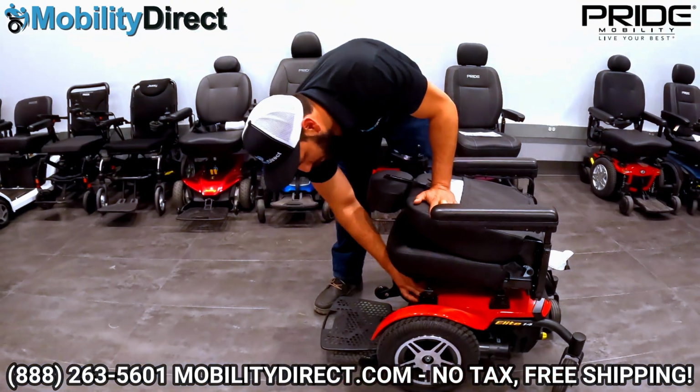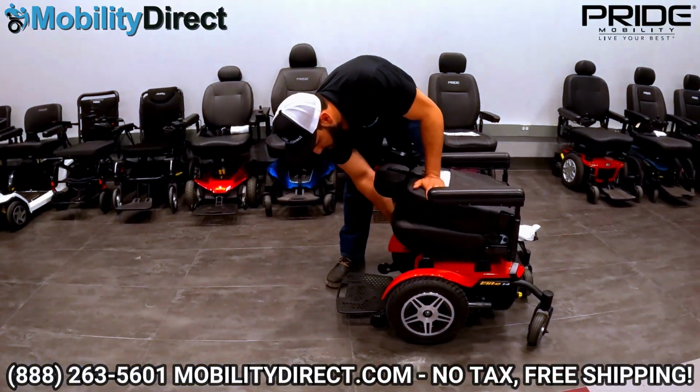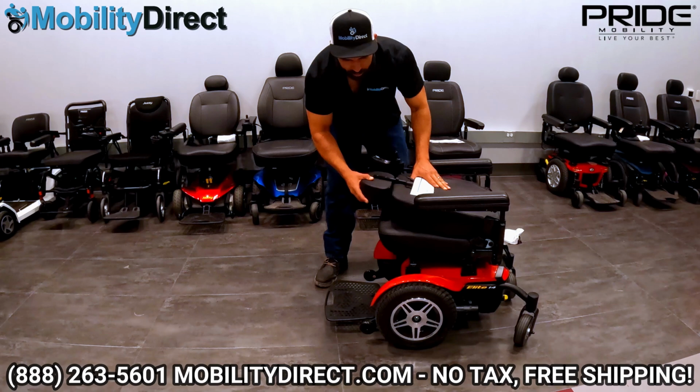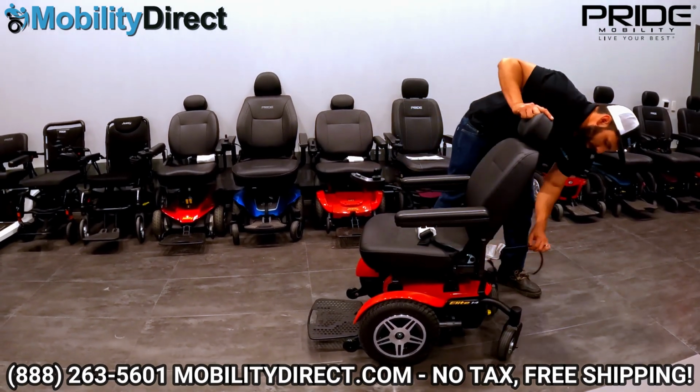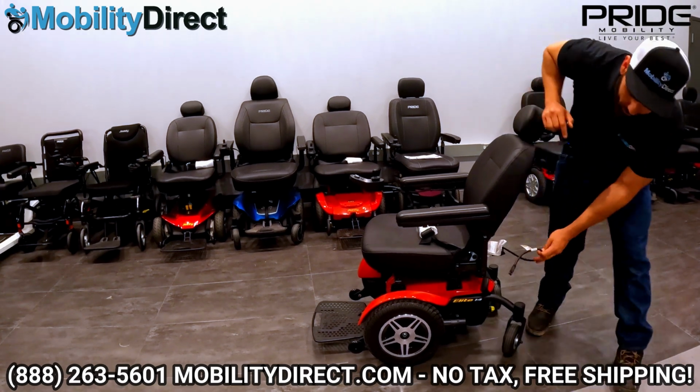I'm going to engage my brake levers again, because remember, your power wheelchair won't work unless your brakes are engaged. See, it's locked in now. It's not rolling around freely. And reconnect my power cable.